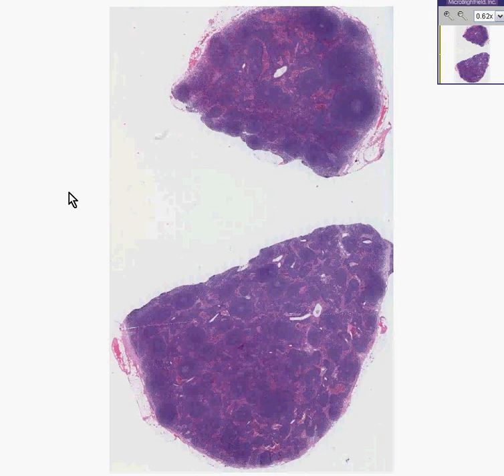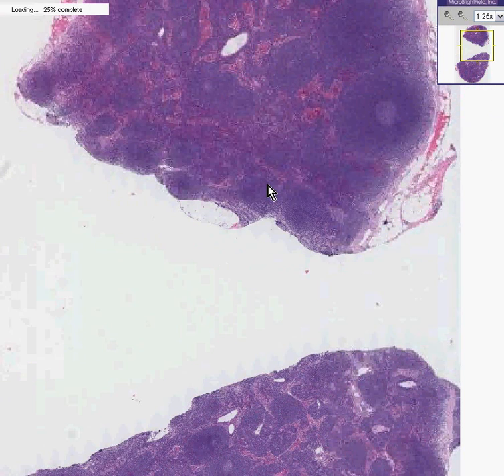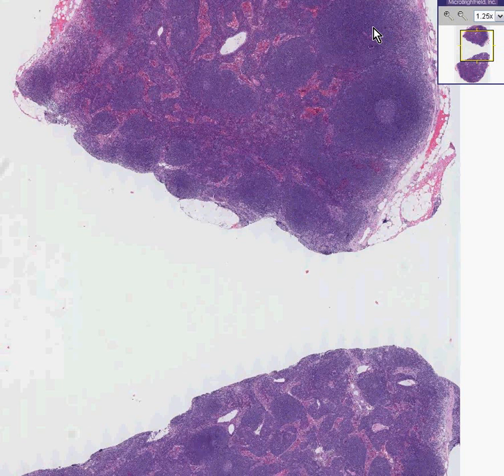Some lymphomas are very easy to diagnose and some are a little bit tougher. This might be a tougher one because at first glance you'll say, hey, maybe this is kind of a non-effaced lymph node — I see some general follicles towards the outside and some cords and sinuses on the inside. Well, this is a hard one to diagnose.